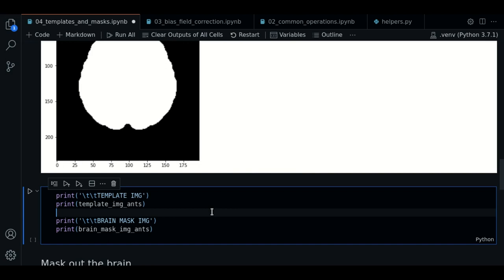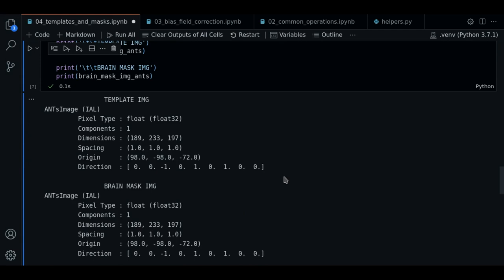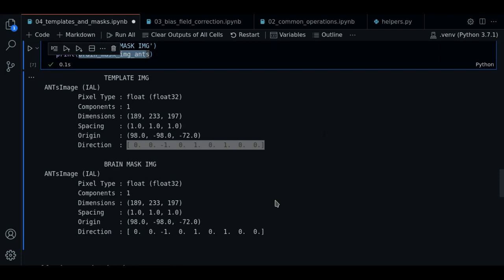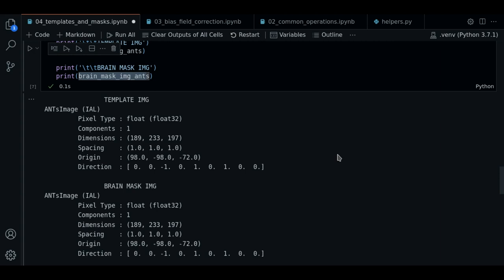So now let's compare the information of the template and the mask. Here we have the basic information of both images. We can see that some items such as the dimensions are the same. The spacing is the same too, also the origin, and the same for the direction. This is a common feature of masks. They share the information of the original image.